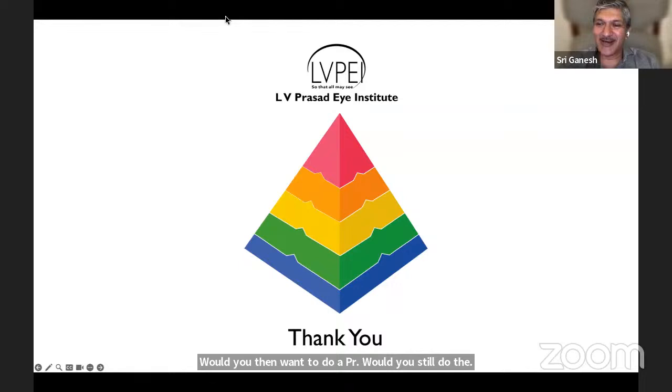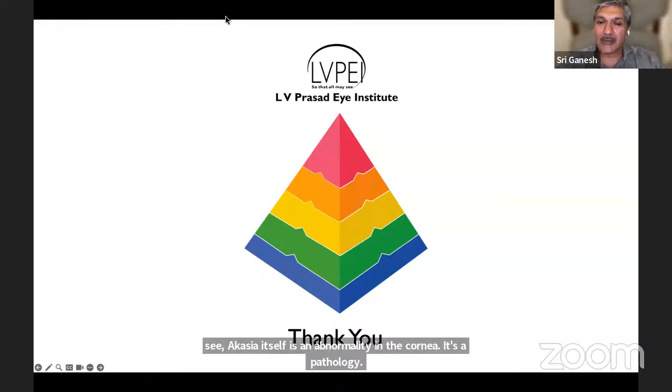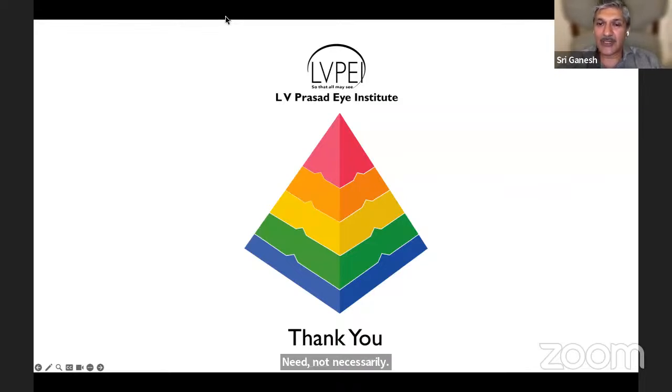See, like I said, I've been doing LASIK for 27 years. And when I started, there were no guidelines on residual stromal bed. We used to use thick flaps. The Hansatom had 160 and 180 flaps. And the percentage tissue altered was probably more than 40% in most cases, because if you lift a 180 flap and then do an ablation, we used to treat even 12 diopters, 15 diopters. But many of those patients have not gone in for ectasia. So see, ectasia itself is an abnormality in the cornea, it's a pathology. And thinner corneas need not necessarily reflect that there is an ectasia. That is something which I want to point out.